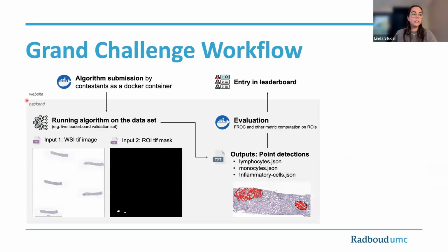Now, I thought maybe some of you are interested in what goes into running a challenge on Grand Challenge, actually. So I've added this slide here as well. Grand Challenge is a platform that provides you with a secure environment to run and evaluate the algorithms completely closed off. So there's no data leakage you have to worry about. You can set up your test set and your validation set completely on the back end securely.